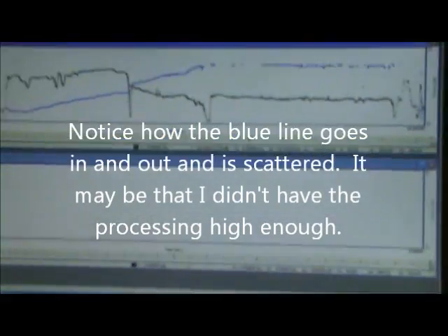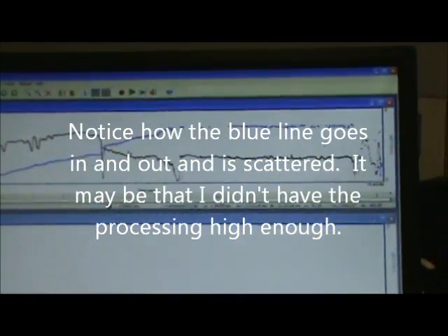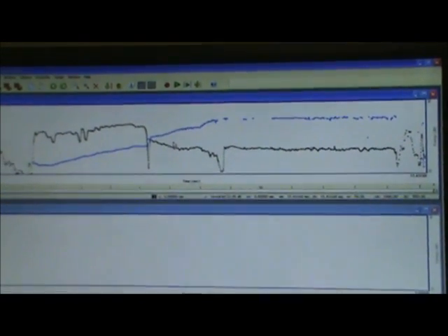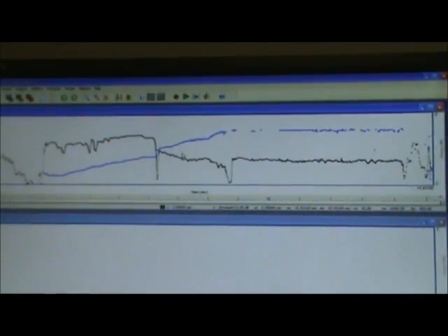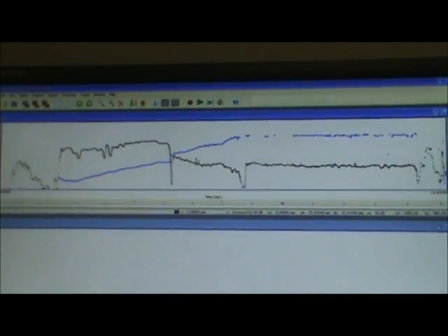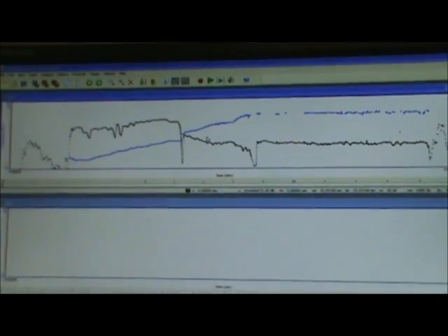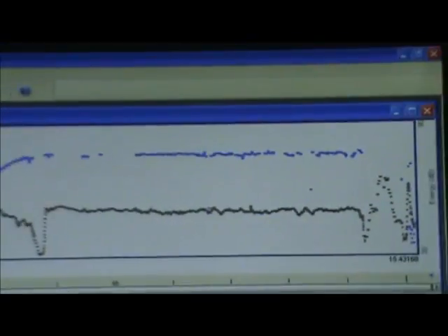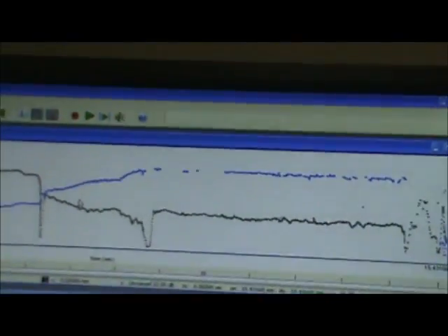Okay, so what you're seeing here is a lot of scatter. And when you get that scatter towards the end of those really high pitches, that's probably not a really great sample of a ceiling pitch. Okay, so I'm going to do it again and see if I can keep it more consistent. But you really want a sample that's a relatively solid line. Like this blue sample right there is probably okay. In fact, let's just go ahead and measure that one right there.